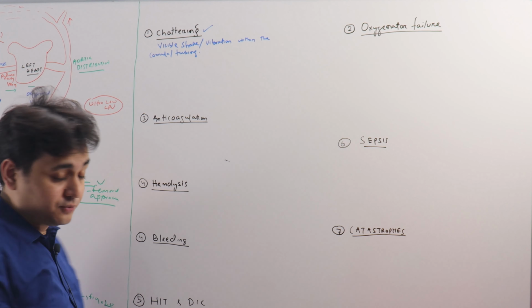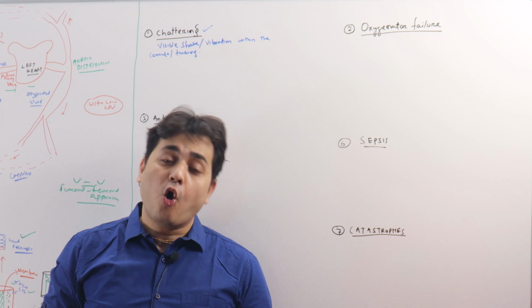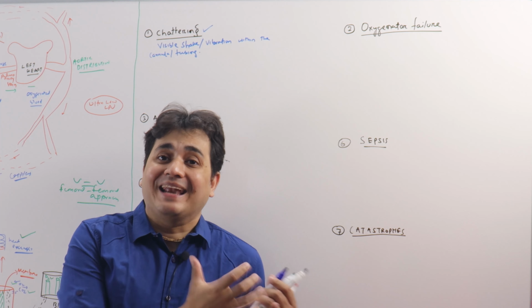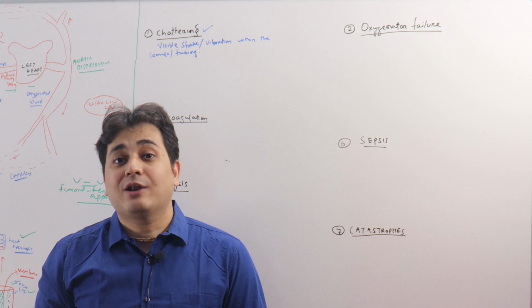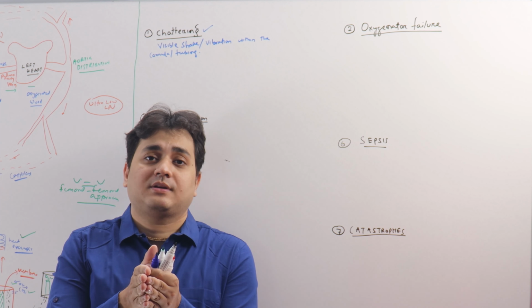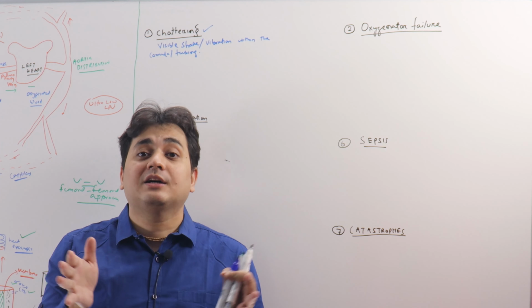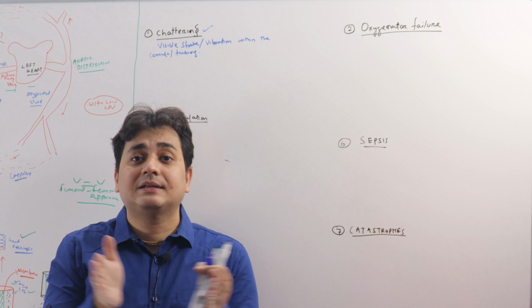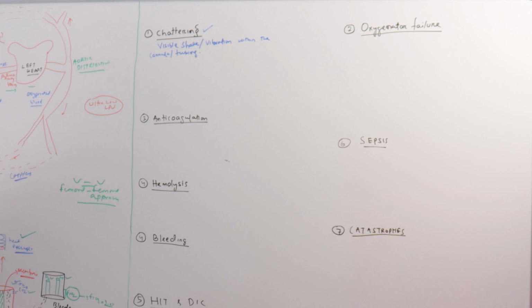This may happen because of creation of high negative pressure, or you are creating the same negative pressure but now there is not enough blood or fluid to be taken, right? So that will cause the vessel to collapse near the rear end of the cannula, causing a vibration or chatter, right?